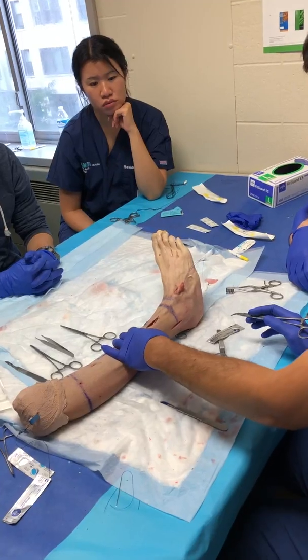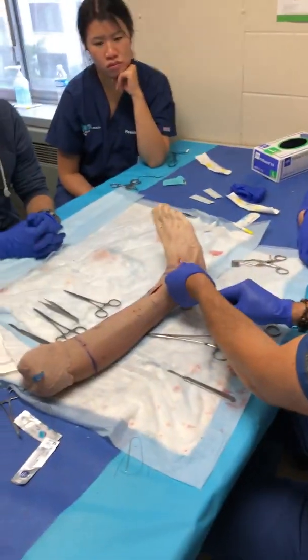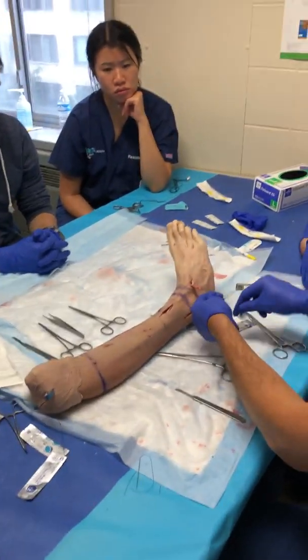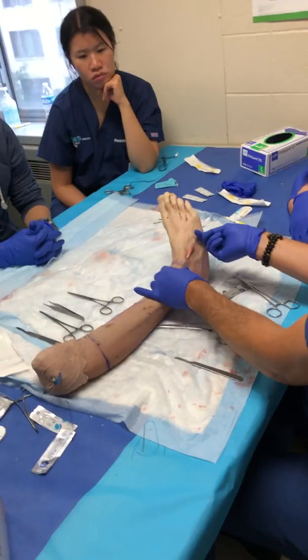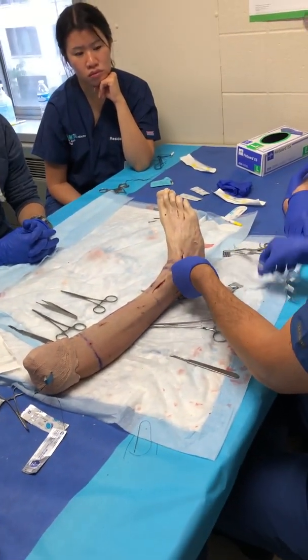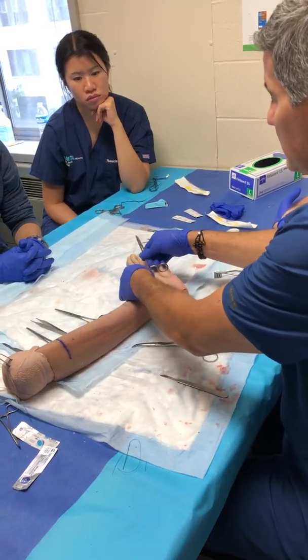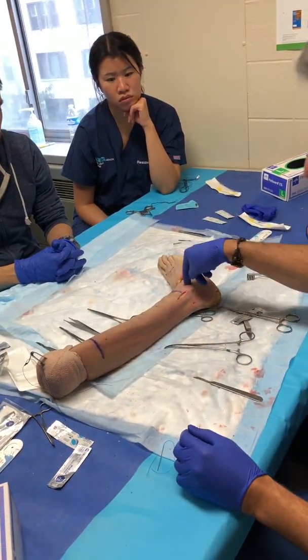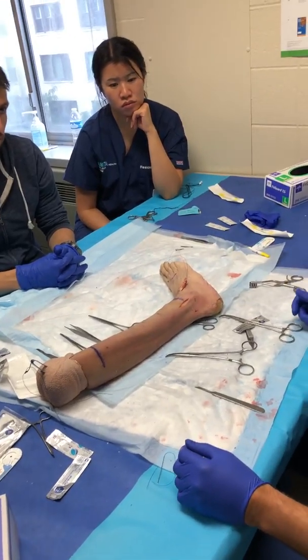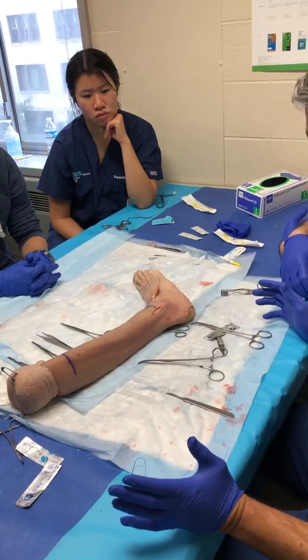It looks like a big hunk. When you make a hole, you make the hole slightly bigger than the diameter of the tendon, of course, because you have to go inside. So they always have like a measuring. You measure that, and then if it's 6, you put 7. Okay? Why? Because you have to put the tendon plus you have to put the interference screw. So now you have two things occupying the same hole. Makes sense, okay?